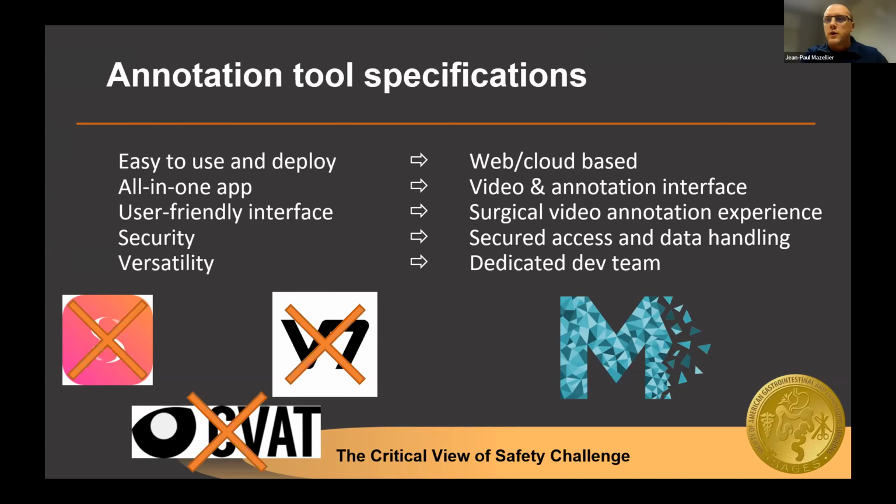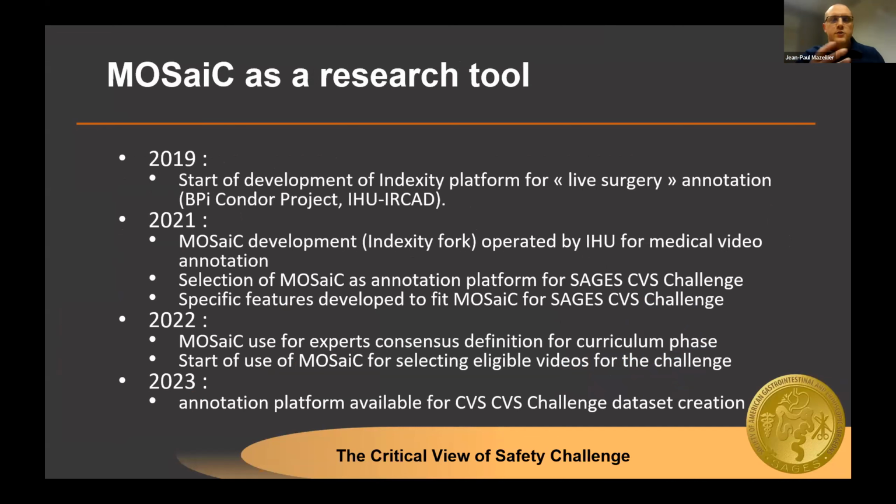So we proposed a tool we are developing at IHU Strasbourg, which is called Mosaic, a web-based annotation platform, which is used to improve the experience in collecting data for this kind of large dataset creation. It's a research tool because we are a research lab, which is not that old.